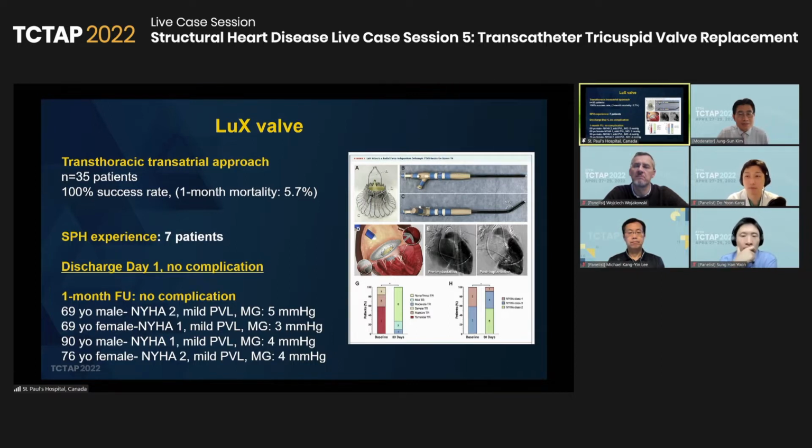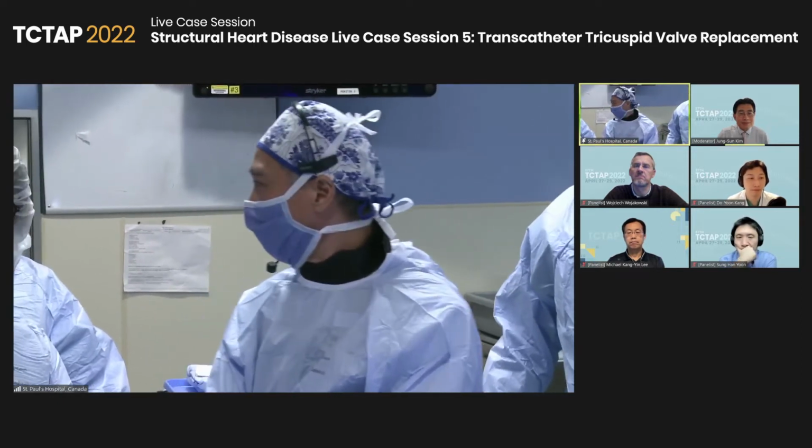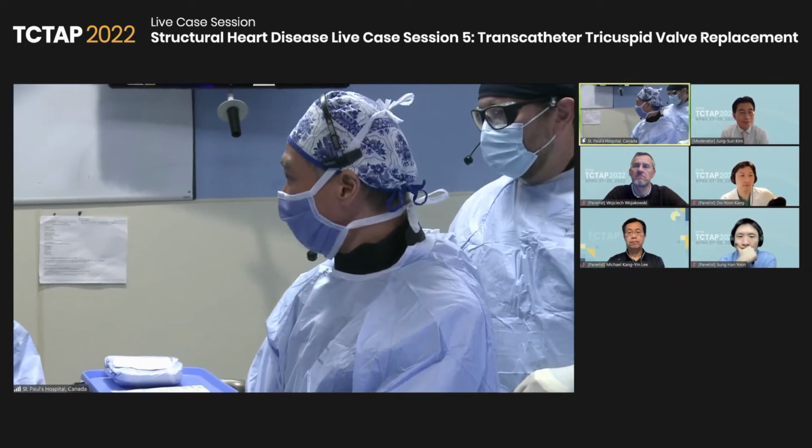Well, I think at this time we should get on with the case, and I'm sure that you're all excited to see it. We'll bring the delivery system up, please.